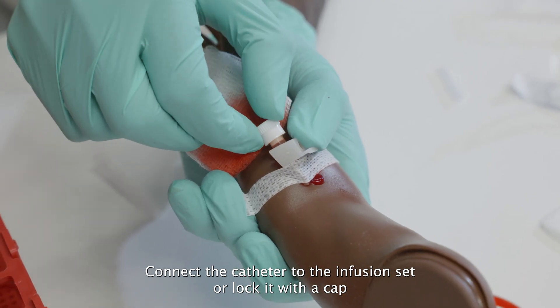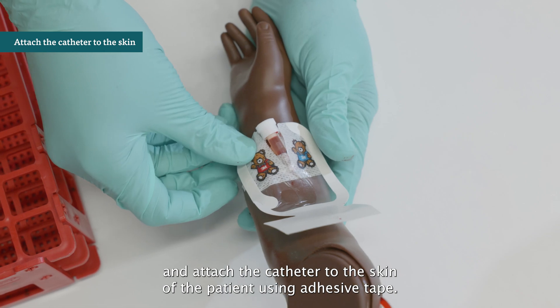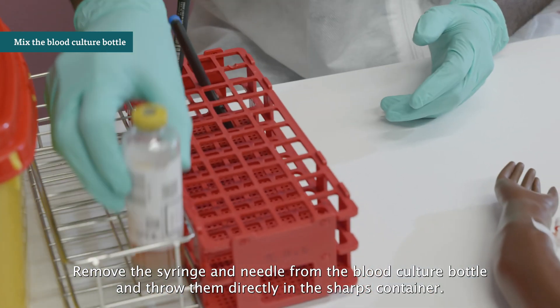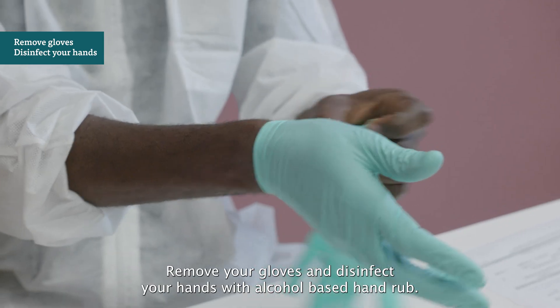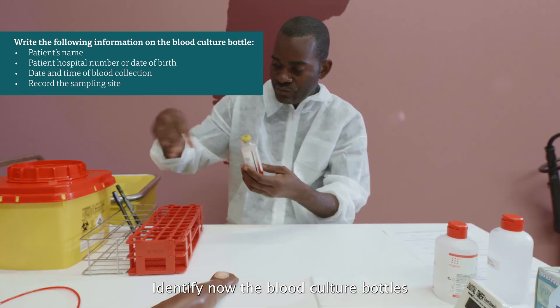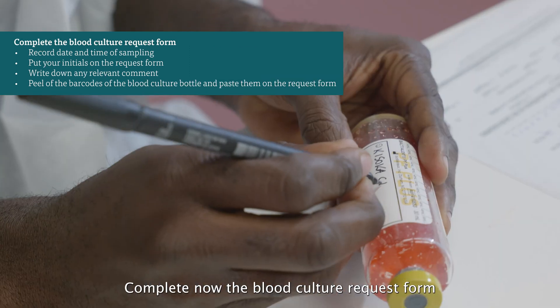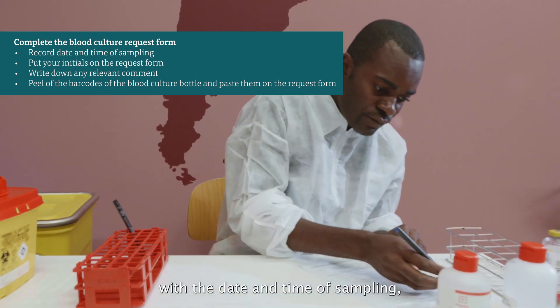Connect the catheter to the infusion set or lock it with a cap, and attach the catheter to the skin of the patient using adhesive tape. Meanwhile, your syringe will be empty. Remove the syringe and needle from the blood culture bottle and throw them directly in the sharps container. Take the blood culture bottle out of the rack and mix it gently, then put it back in the rack. Remove your gloves and disinfect your hands with alcohol-based hand rub. Identify the blood culture bottles with the patient's name, the patient's hospital number, the date and time of blood collection, and the sampling site.